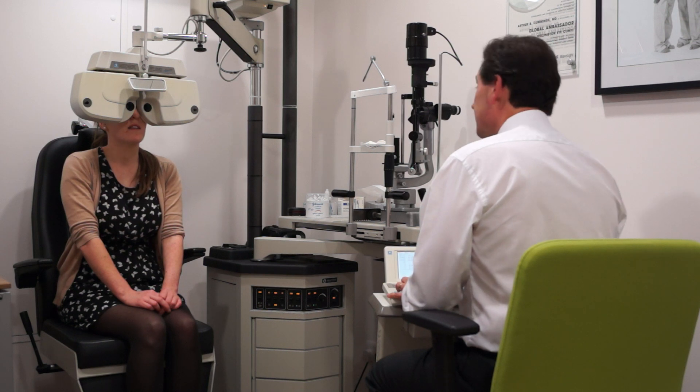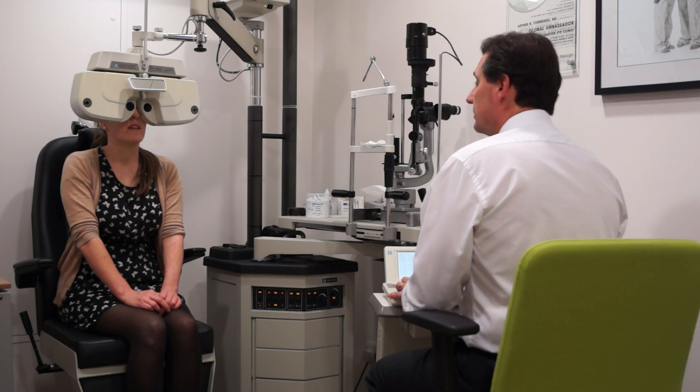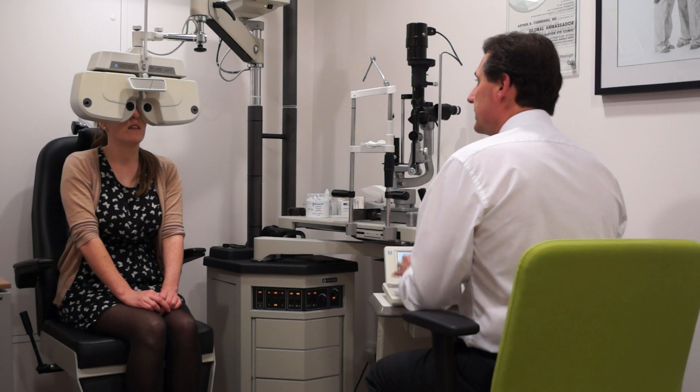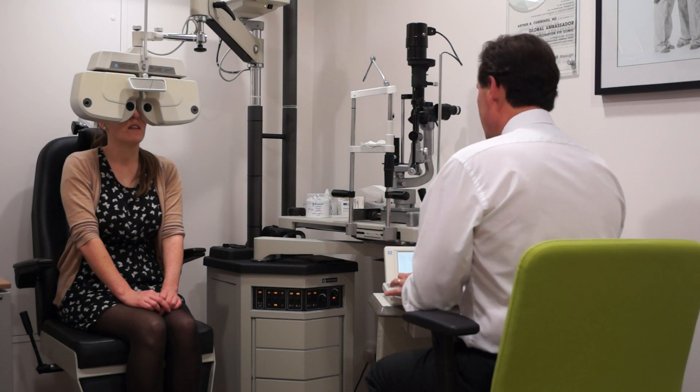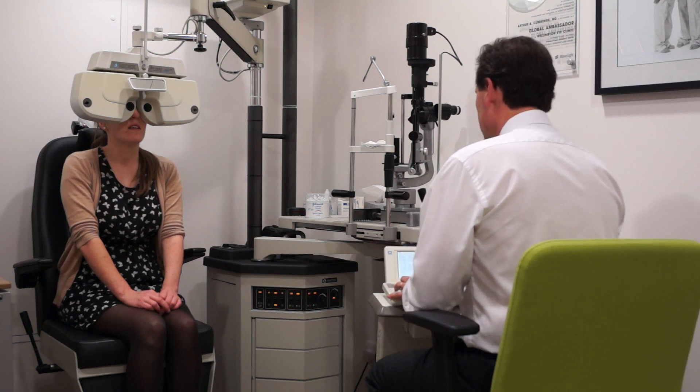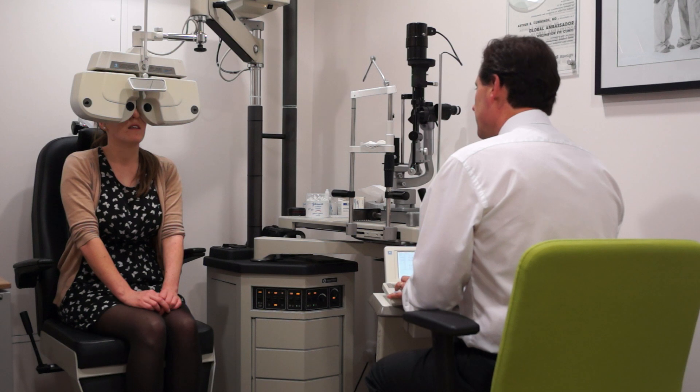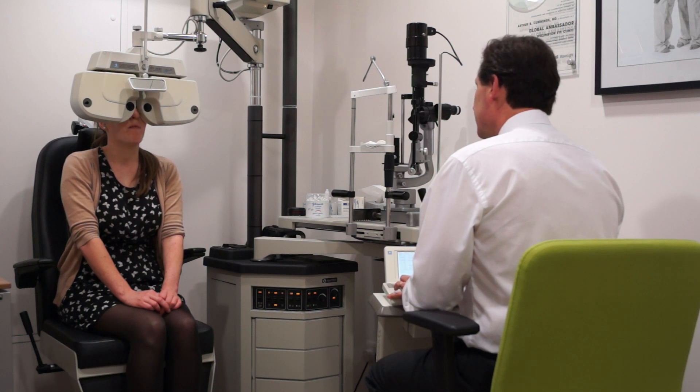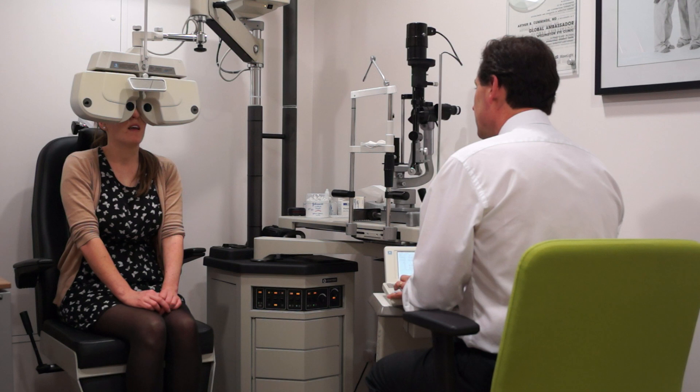All right. So that was the mini monovision. That fits in well. With mini monovision, you said that looks quite good. And with mini monovision, you still have stereopsis. This is one and a quarter.